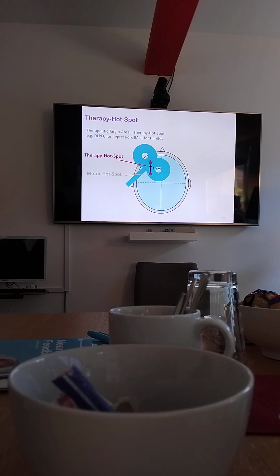If you run with a high dose, a high level, there is a certain possibility that you create an epileptic episode. But I think every year around the world a couple of 10,000s of persons are treated with this system, and over the last years there were, I think, 2 reported cases where such an epileptic episode was created. So it is possible, but the possibility is really, really slim.